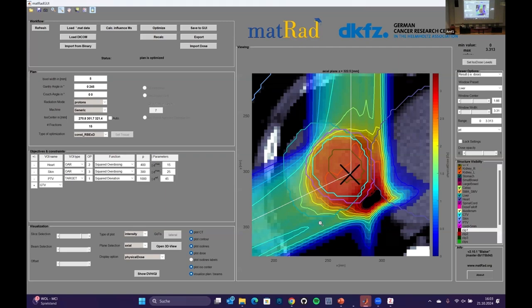People try to get around this by using dual energy CT, so they get a little bit more information about the tissue. There are also some products doing this. You could do a proton CT, for example, but protons are not very nice to do tomography with because they scatter quite a lot, so the images are not as well resolved. So it's an imaging problem. It's a problem of the image that you do for planning. It's a problem that you don't have an exact image at the time when you are irradiating.